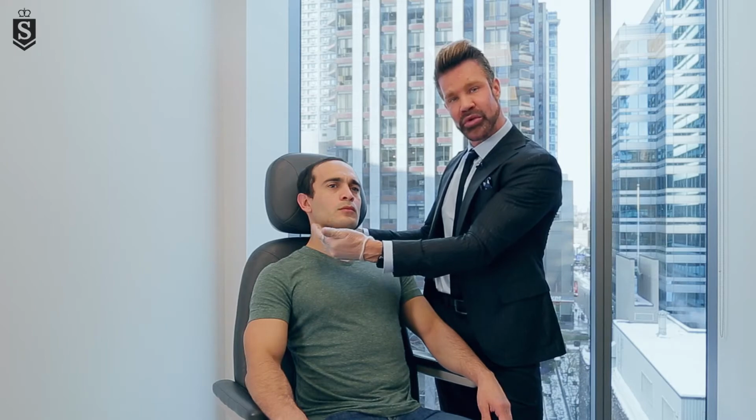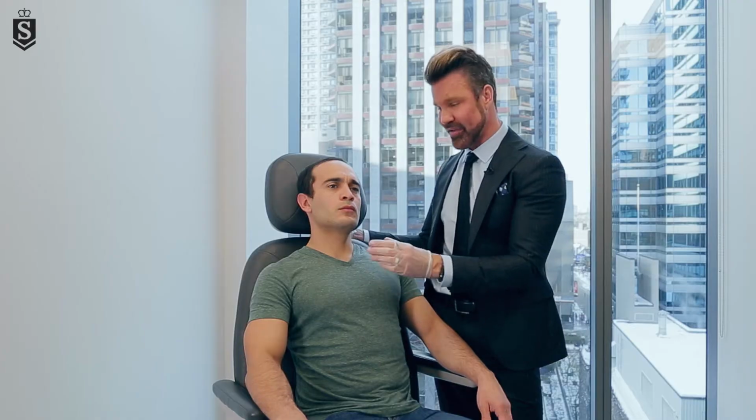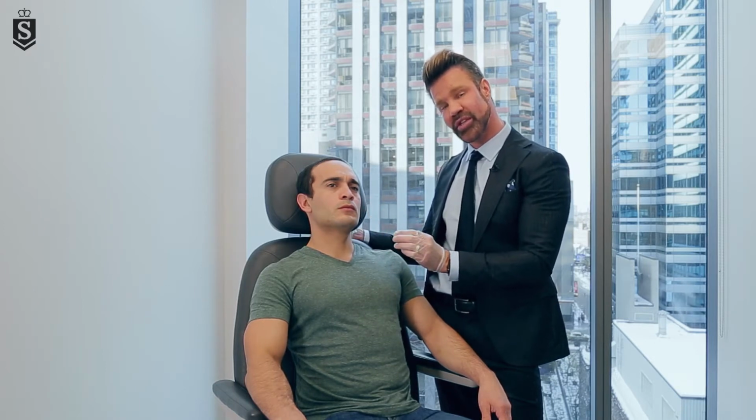In this 33-year-old patient here, we're going to do some jawline contouring, which is really going to square off his posterior jawline and really bring out and project his anterior jawline. This is a very masculinizing effect. So we're going to actually use filler here in this case to give him a stronger, more masculine jawline profile. We'll also do a little bit of volumization in his tear troughs and in his mid-face in order to produce a little bit more connection and make him look a little less tired.